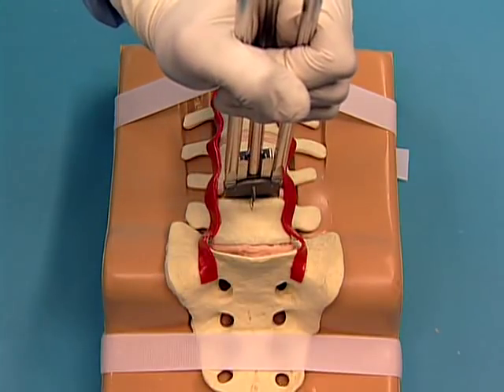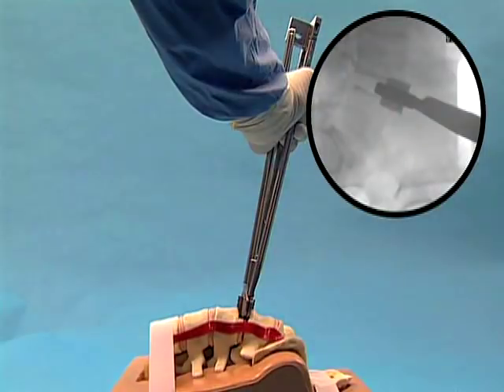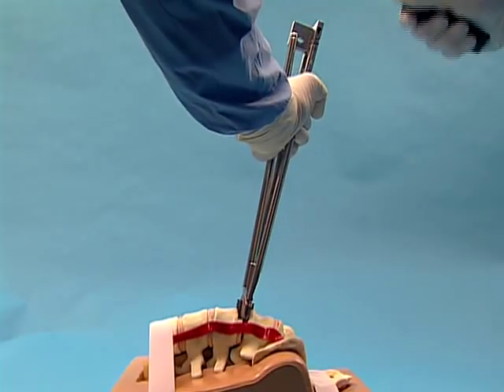Align the keels of the ProDisc-L implant with the chisel cuts. Under fluoroscopic control, use the slotted mallet to insert the ProDisc-L end plates to the posterior margin of the vertebral bodies.